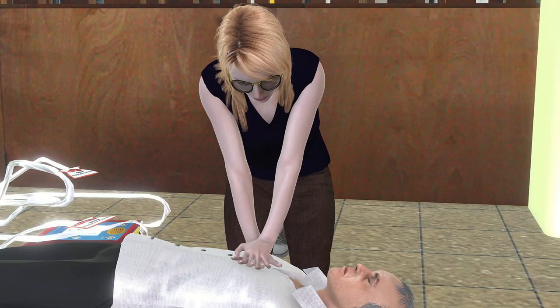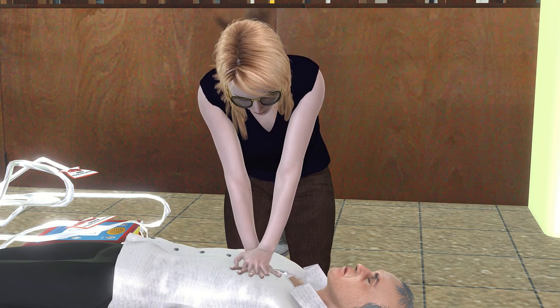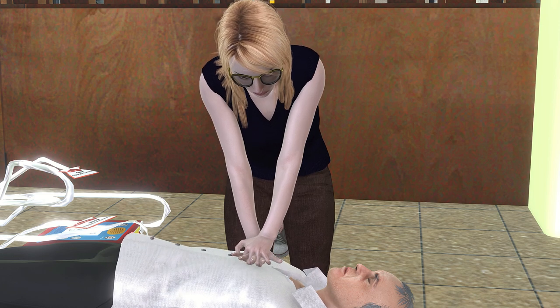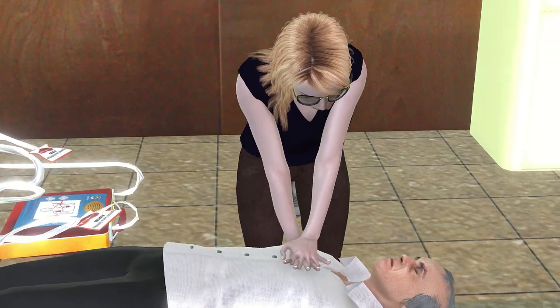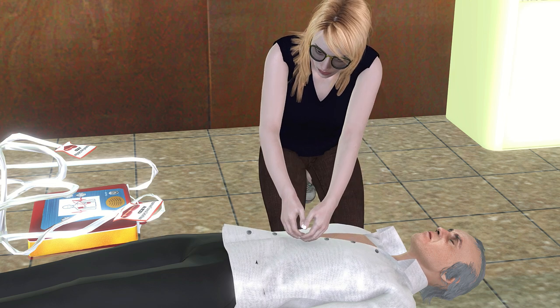The AED, or automated external defibrillator, is the only thing that will shock the victim's heart back into a normal rhythm. And when the AED arrives, the first step is to turn it on and follow the voice-guided instructions. The AED may say no shock advised. This means that the heart is not in a shockable rhythm. It does not mean to stop CPR.